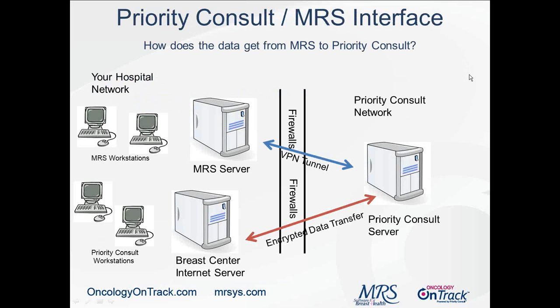The information comes over through an interface from your MRS server to the Priority Consult application, obviously through an encrypted data transfer. We won't spend much time on this, but this basic schematic shows you how information does flow from the MRS application to Priority Consult.